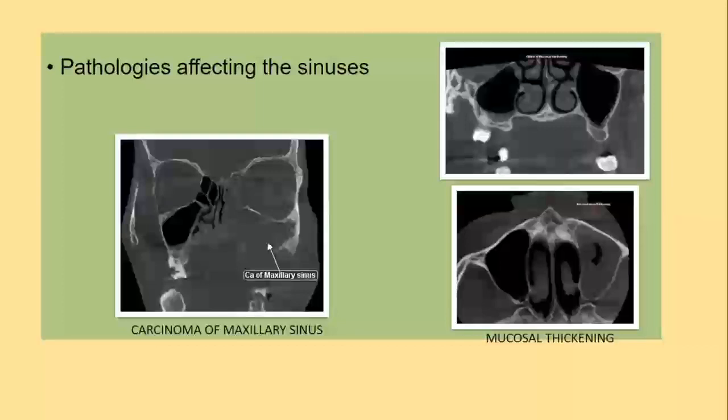In the last 1 year, I saw a couple of case reports mentioning mucormycosis, but nothing to take from there because they just mimic every other destructive lesion, just like carcinoma. So if you picked two CBCTs, of a carcinoma and a mucormycosis, I wouldn't know the difference. I'll just say there's extensive destruction. I'd probably put them in one of the differential diagnoses.